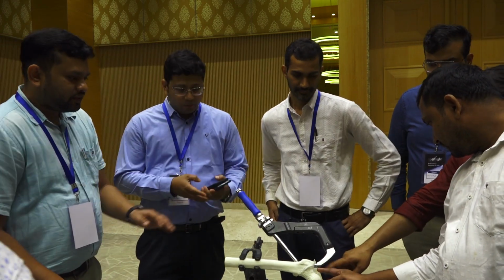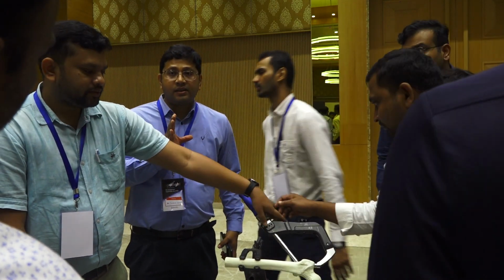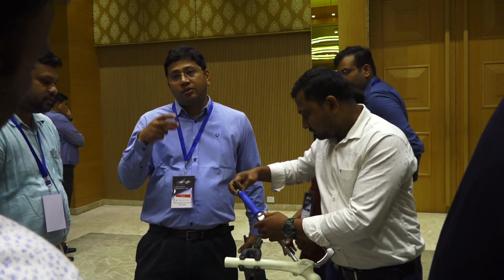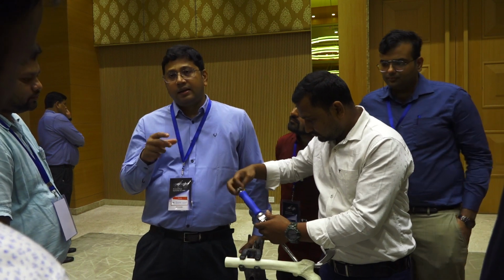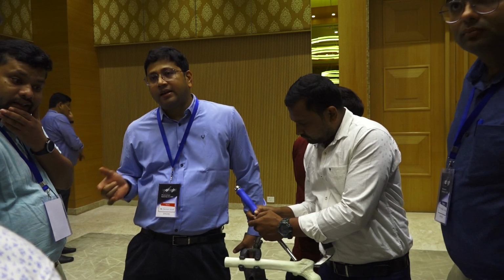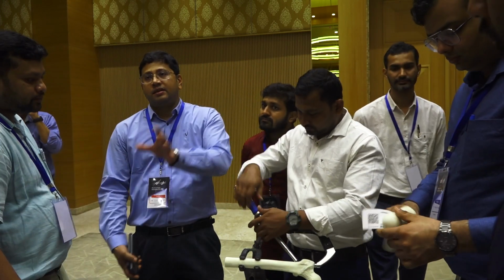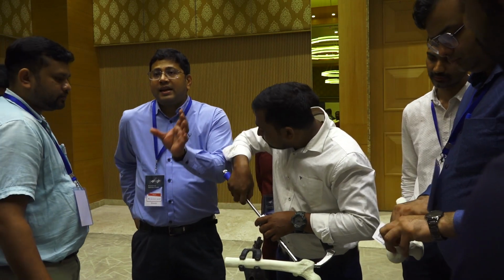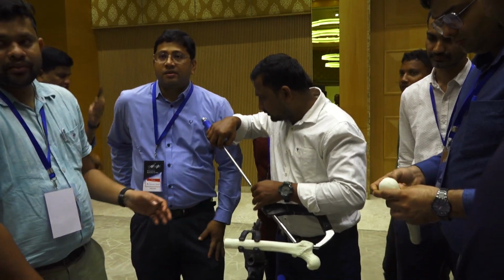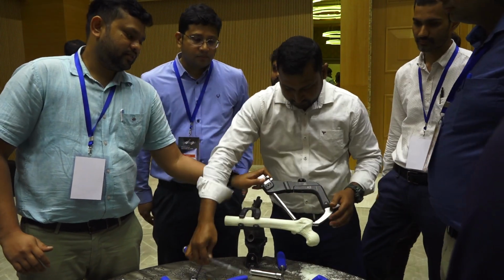Suppose it is an osteoporotic fracture, it's a very stable fracture. I will lock the blade to the nail, and it's a static device now. I will not put a dynamic interlocking screw this time. It's a single unit. So whatever dynamism I expect, I expect it from the distal. The way the first generation came.